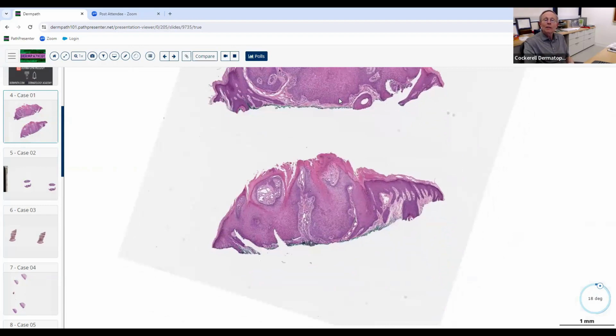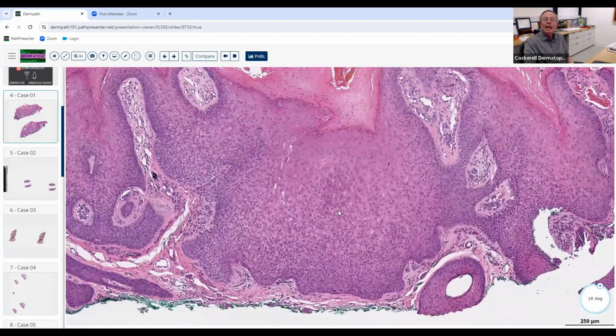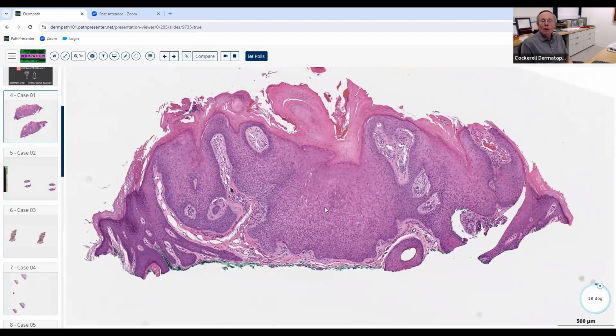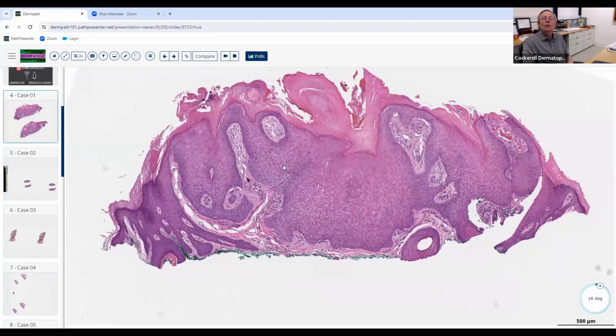So you're taking the board examination, and you see this. It's your slide. You look at it, and you think you know what the answer is, and you look down there, and they've got several things in there that might try to throw you off. What's probably the number one thing they're going to put in there to try to throw you off? Besides a wart, perhaps a clear cell acanthoma. They might, because it's got the clear cells.